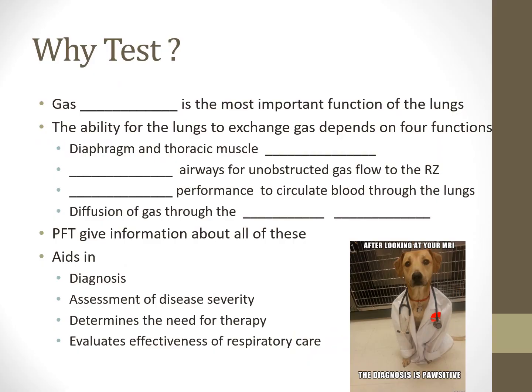So the first thing that we'll talk about is, why do we do pulmonary function testing? And when we're doing this, this is looking at gas exchange. Gas exchange is what should go into this box here, right? Gas exchange is the most important function of the lungs. Do you not agree? Gas exchange between the alveoli and the capillary is a crucial role to life. If you can't ventilate and exchange CO2 and O2, then you can't get oxygen to your bloodstream. You can't get oxygen to your brain. You can't get oxygen to your tissues. That also means you can't get rid of CO2 from your tissues, right? So life tends to not live so long if you can't ventilate or breathe, exchange gas.